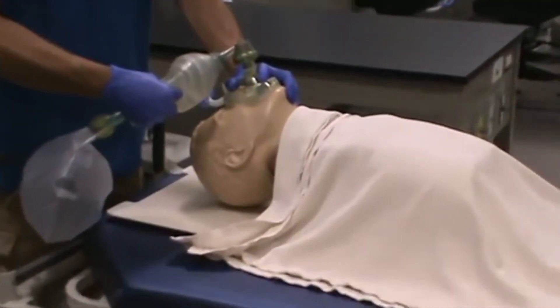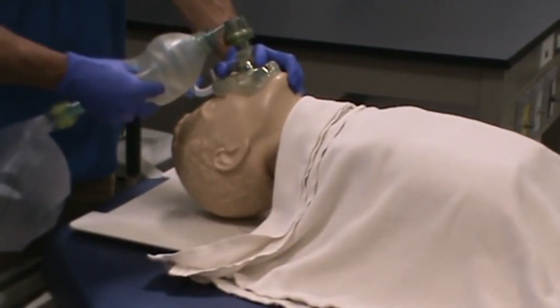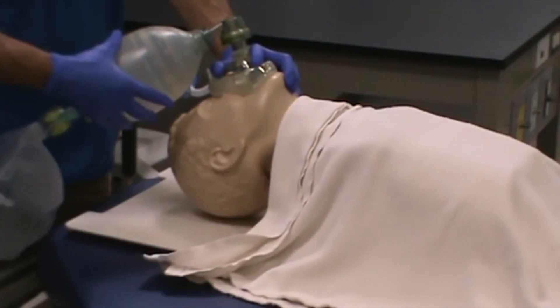Just focus on the rate and the volume you want your patient to get. Make sure you have good chest rise, but you don't want to use too much pressure to have an excessive chest rise either.